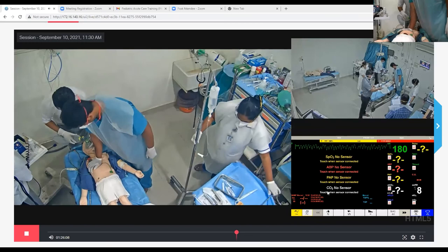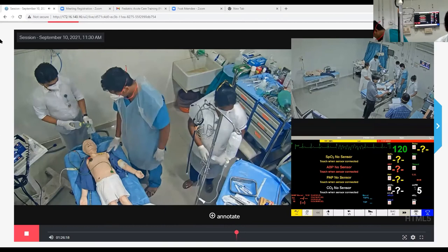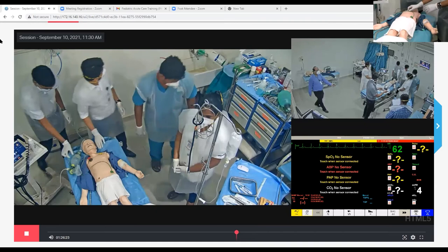Continue CPR. 1, 2, 3, 4, 5, 6, 7, 8, 9, 10, 11, 12, 13, 14. Good job. I think we'll see the pulse and the rhythm. Rhythm looks okay. Is the pulse good? No pulse. So it's still in PEA. Can we continue? Are we missing anything?